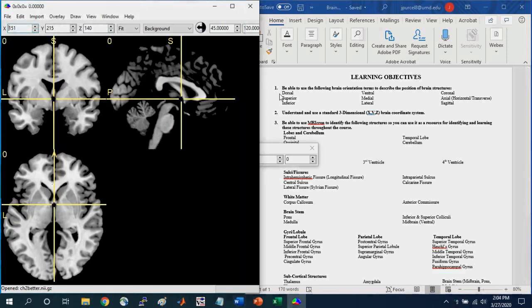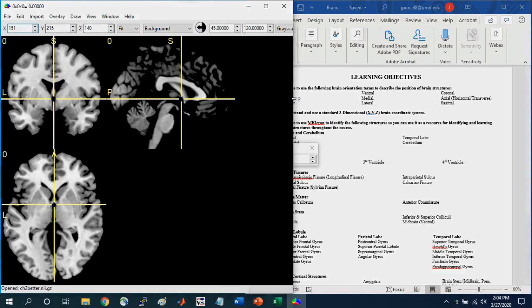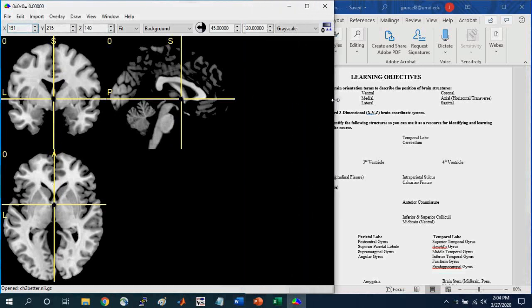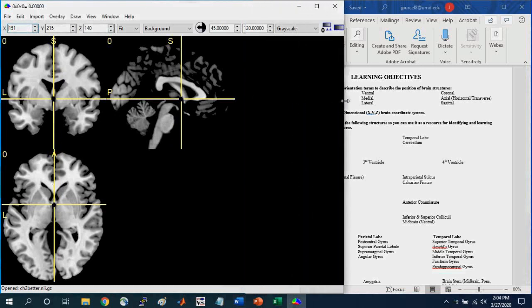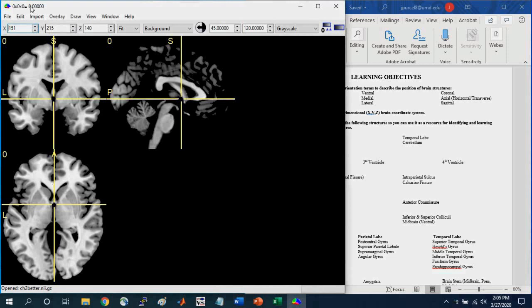Another thing I want to point out is what the intensity values mean. And so here I'm at the zero, zero, zero coordinate. And you can see up here the intensity value associated with this specific voxel. And it's zero.